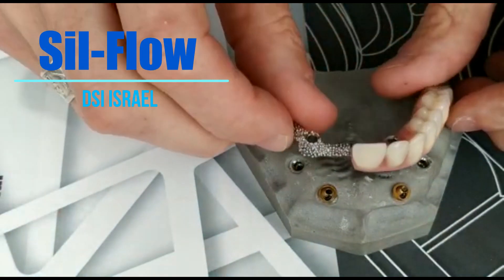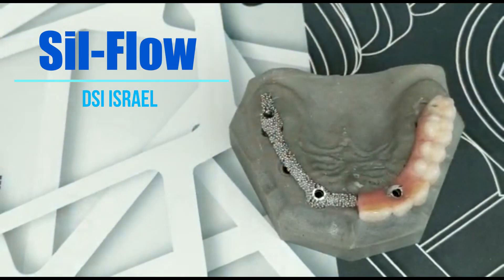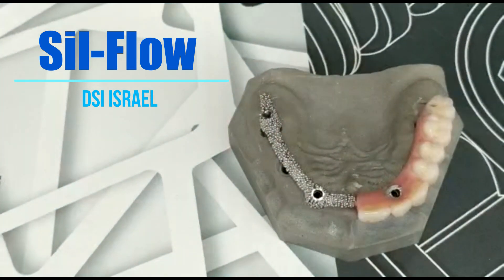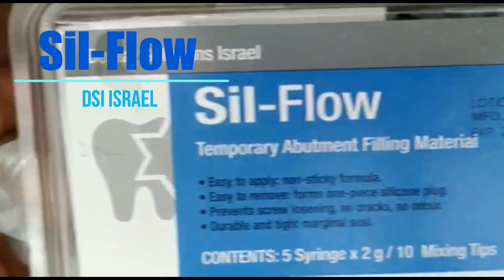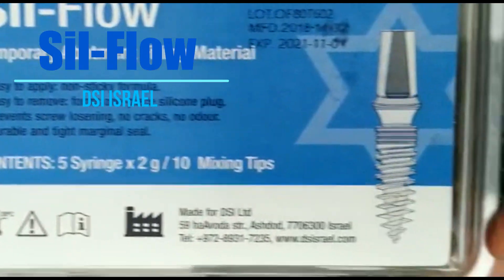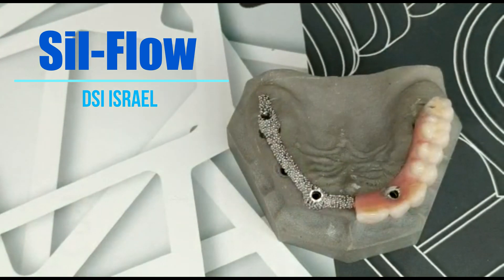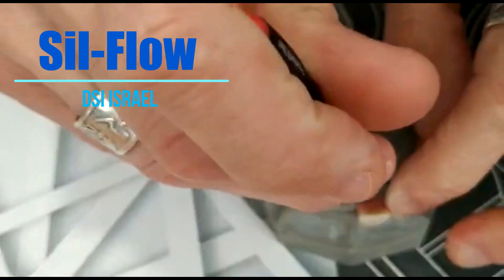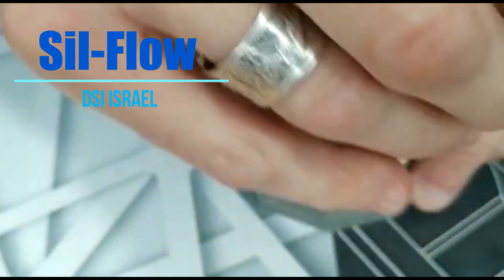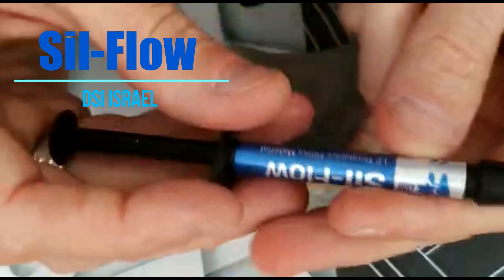And now I will show you another material, especially developed by the company. This material is developed for the purpose of closing the sleeve hole of the screw. No need to isolate.